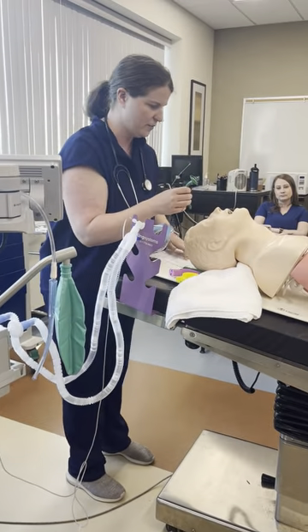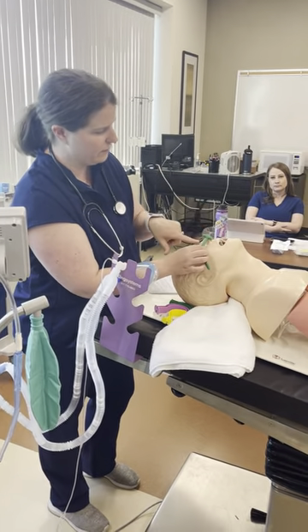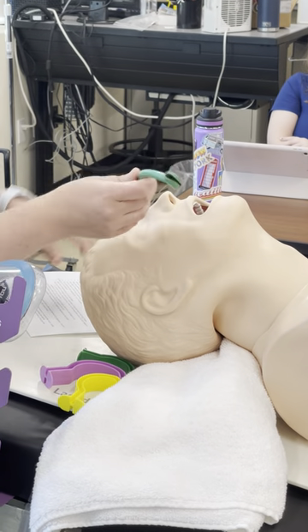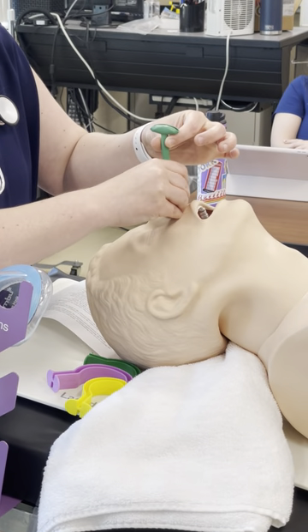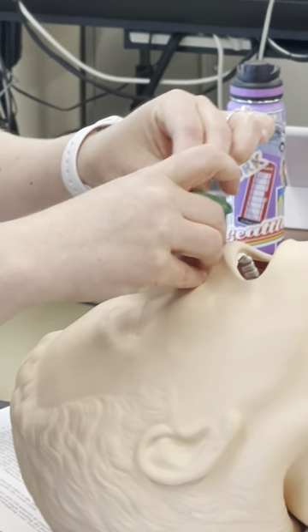This is a pretty small nasopharyngeal airway. It would be measured from the flange of the NPA down to the earlobe. The patient's head has to be extended and you come in straight down like so.